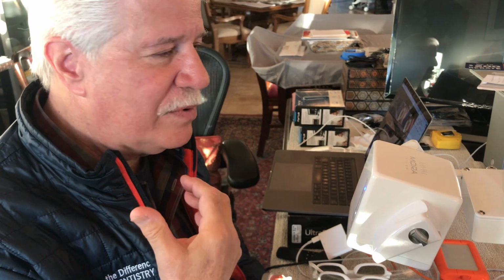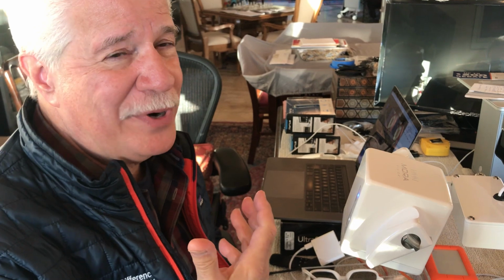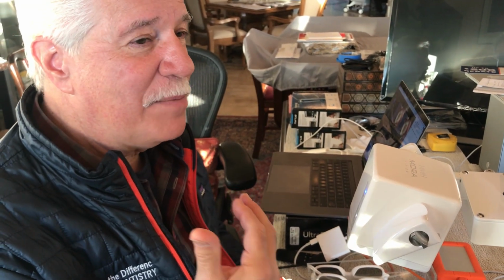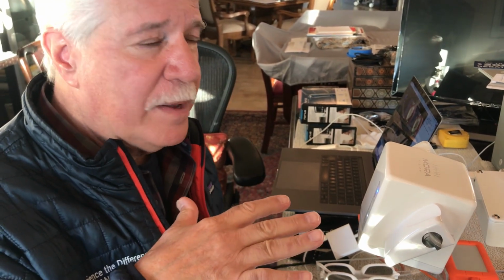And the only reason for thinking about going with a digital option, and there are many reasons, but one of the biggest reasons really is for patient positioning. Because still, whether you're with loops or with a traditional optical microscope, the biggest challenge is that not all patients can lie flat. Especially older patients or patients with neck issues or vertigo issues. We can't treat them in our office because for us to be working on the microscope, the patient has got to be pretty reclined.